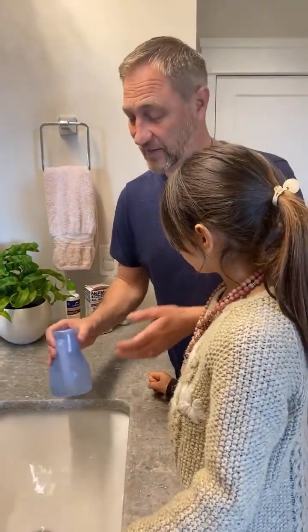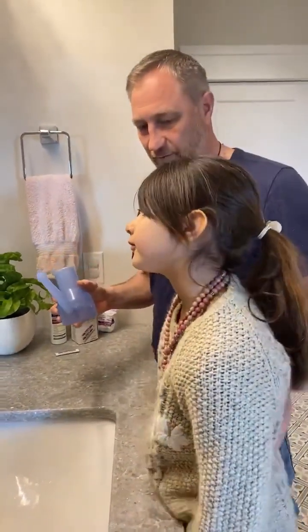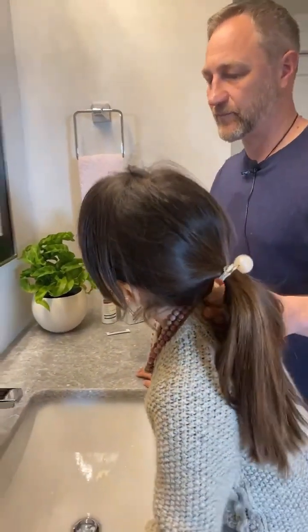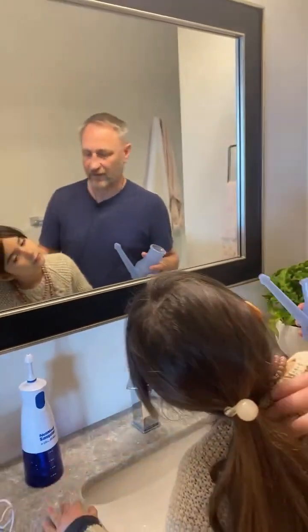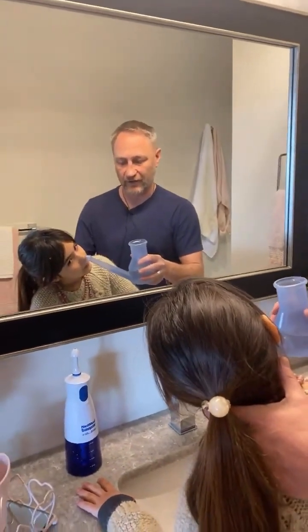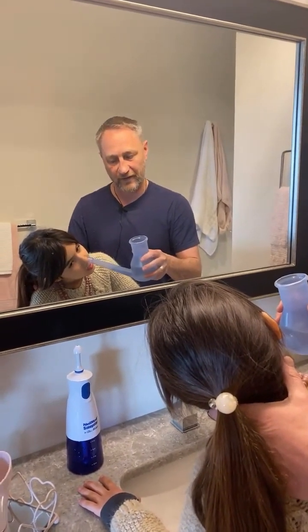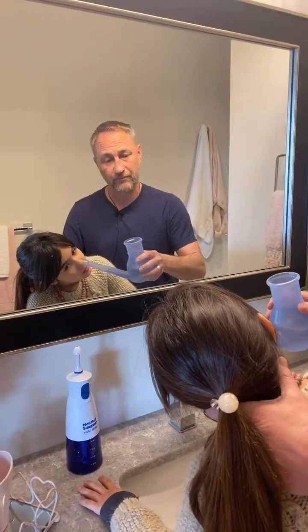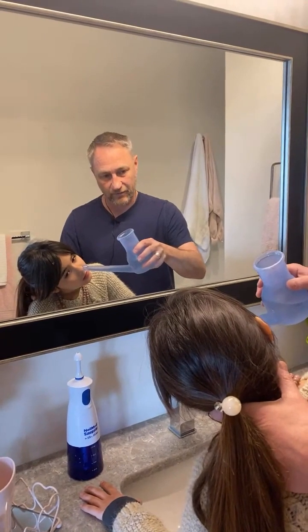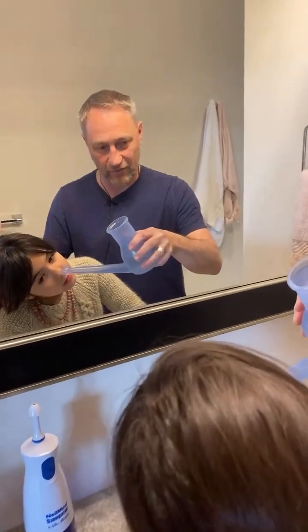If you're a parent just starting this with your kids, go ahead and lean them forward — tilt the chin up and slightly over to one side so they're looking a little towards your side. Put the neti pot right into their nose, ask them to take a deep breath in, breathe out, and then hold their breath out. If they need to breathe, breathe through the mouth — keep the mouth open. Remind them to breathe through the mouth as you go through, and you'll see it dripping.